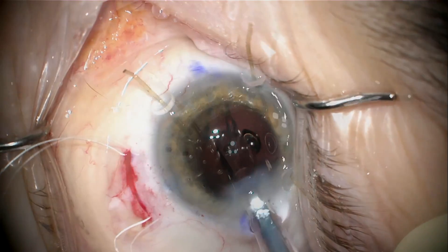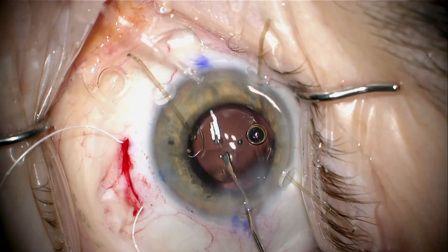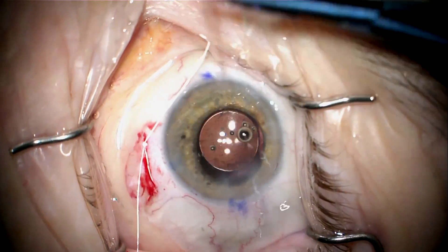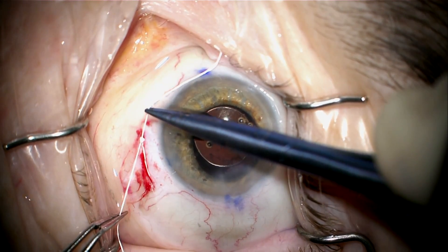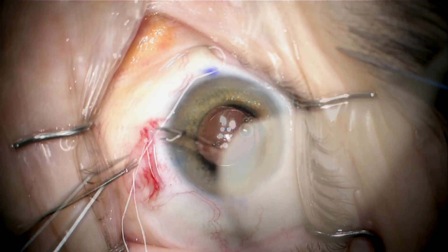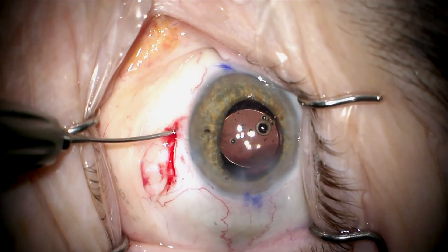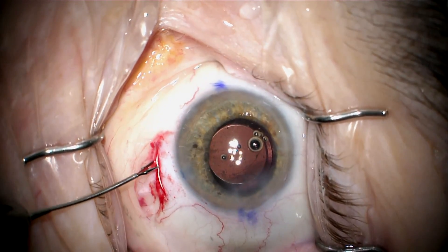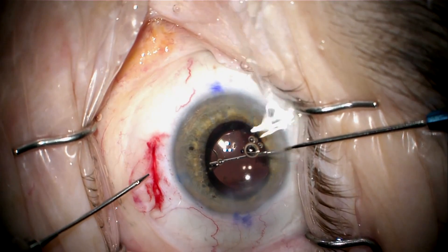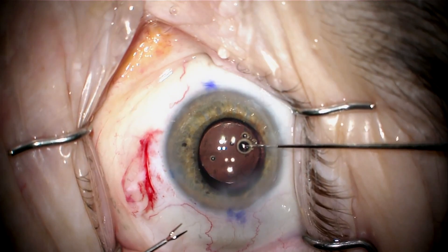That will actually support the side of the capsular bag quite well as I inject my toric single-piece acrylic lens into the capsular bag. I rotate that into the position I marked at the beginning of the case. When I tie my suture, I do a 2-1-1 knot and try to adjust the tension very carefully so it's just tight enough to secure the inferior capsular bag without pulling everything over. I rotate the knot into the eye, and you can see there's a little slack — I'll pull from inside on the eyelet and tighten that up a bit so the suture lies under the scleral surface at the base of that scleral groove.